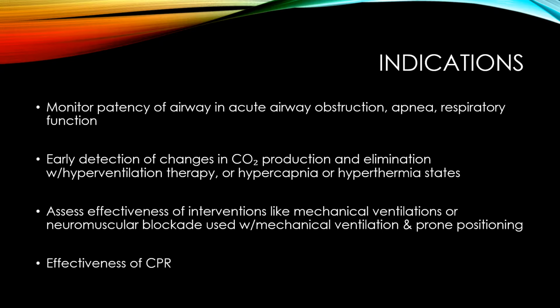But with this, if you're monitoring the end tidal CO2 levels, and let's say you're doing compressions and your reading is at like 18 millimeters of mercury, pretty consistent, you're doing good chest compressions, the reading is there, and then it suddenly jumps up to 26, stop and check for a pulse, because you may have had return of spontaneous circulation, which is absolutely what we were looking to do.